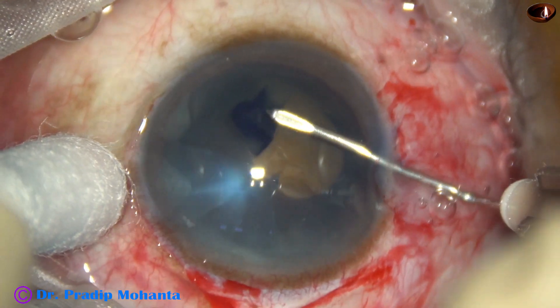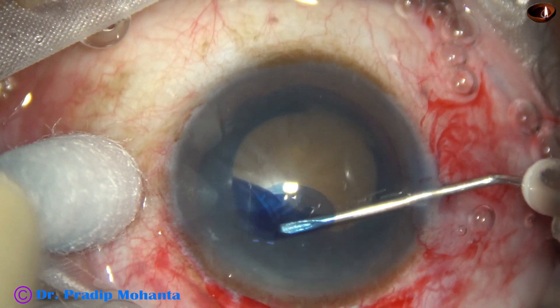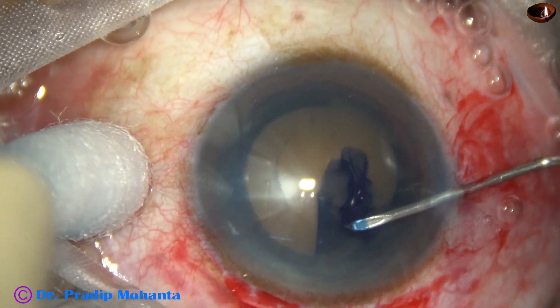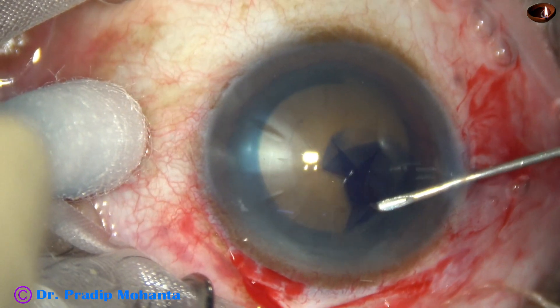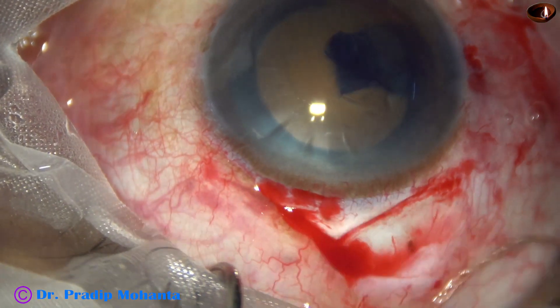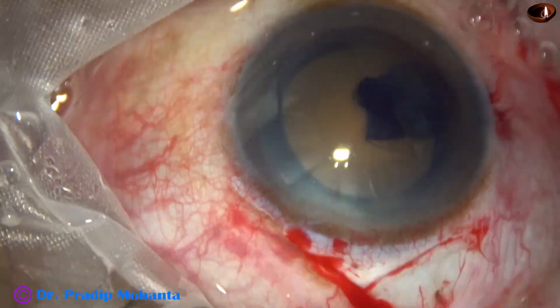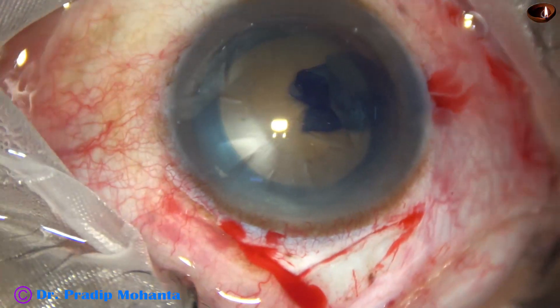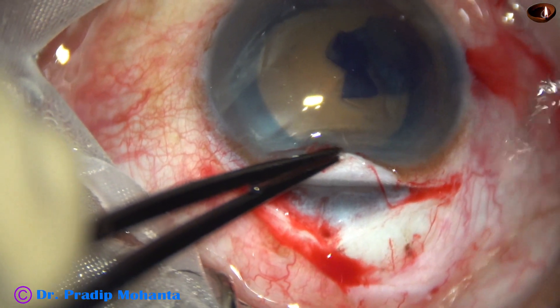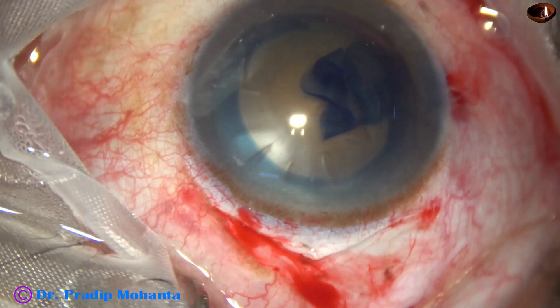I started the rhexis with utrata forceps — control is more. But with a needle, we can manage rhexis in most cases. The rhexis is adequate, but if given a second chance, I would do a larger rhexis, a little larger. And now the tunnel is opened from one end to the other end.